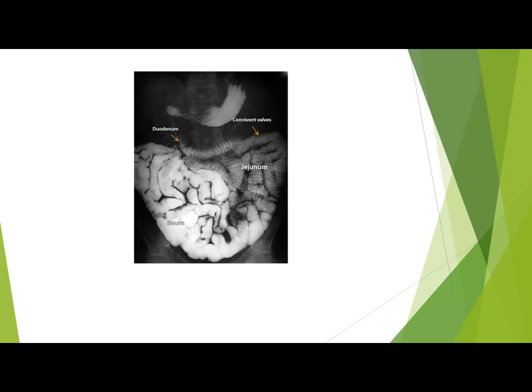This is so most likely about the stomach, so there will be reflux, I mean, if you put the tube in the duodenojejunal flexure. It should be in the duodenojejunal flexure. Yes. Maybe they removed it and something refluxed. I don't know.